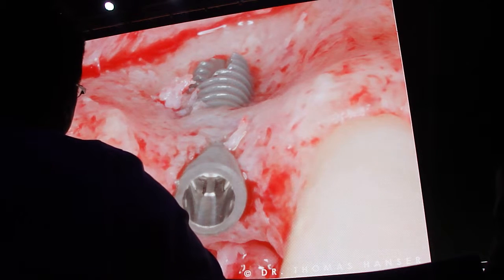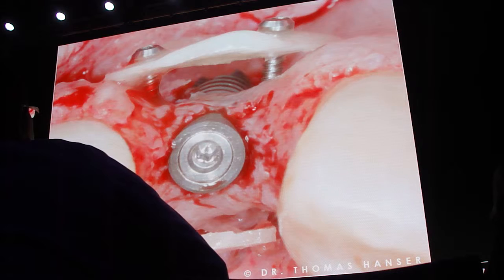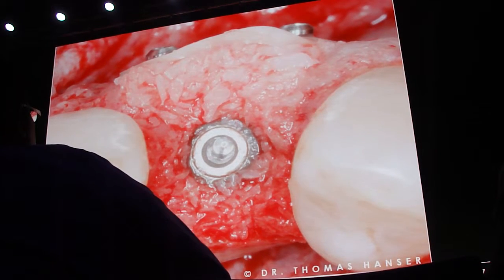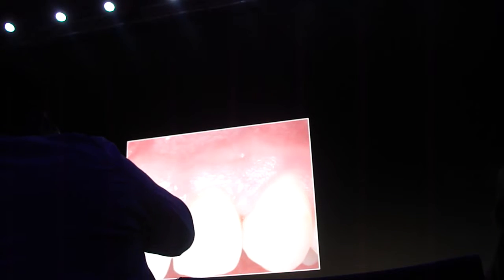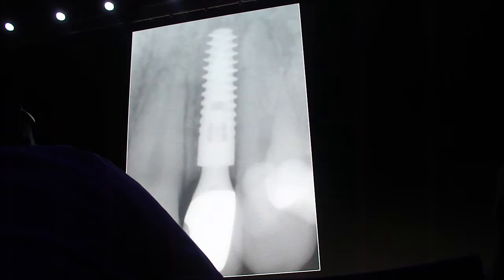So coming back to the case which I started with, we had to rebuild bone in 3 dimensions. We had a vertical defect, so there was a palatal and a buccal bone membrane fixed to each other, creating a stable biological space and filling up this space with pure autogenous bone chips according to our biological concept. So in most of the cases, we are able to combine implant placement and the grafting procedure in the aesthetic zone. If you have a look at the situation 10 years after the implant restoration, we can still find a very stable clinical but also radiographic situation.